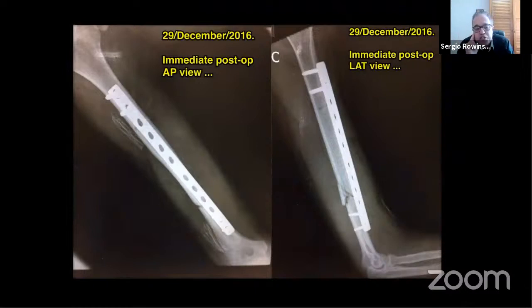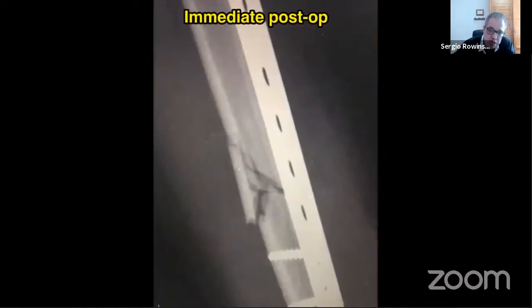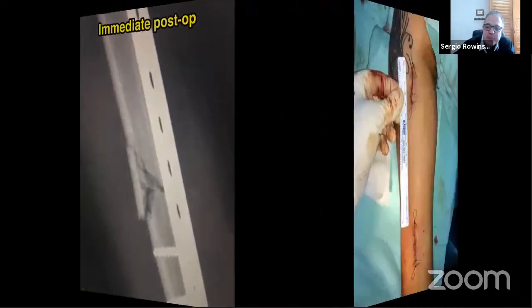Different from Dr. Belangero, I always use the two last screws, the penultimate and the last one, up and down, 12 hole plate, non-locked screws. This plate could be a little bit more inferior, but what I've been learning in 15 years is that as long as you can put two up and two down, you can do the job. So this is the focus just after surgery.